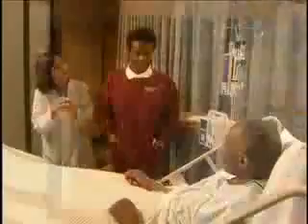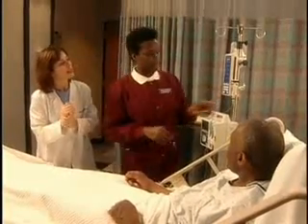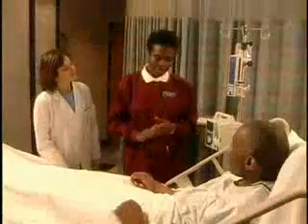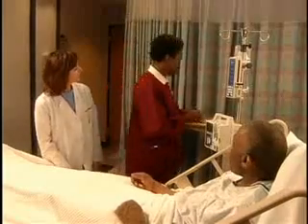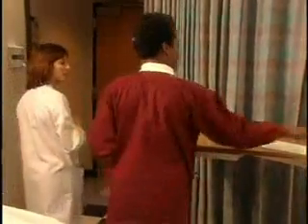Hello. Now that the infusion is complete, you can press the off button on the pump, disconnect, and properly discard the tubing. Okay. Next, I'll recheck the primary infusion and document the medication administration. Very good, Tamika. Everything okay, Mr. Nixon? Great. Great. We're all set. I'll check back with you in a bit, okay? Thank you. Thank you. Let me grab that, and we'll take that with us and discard.